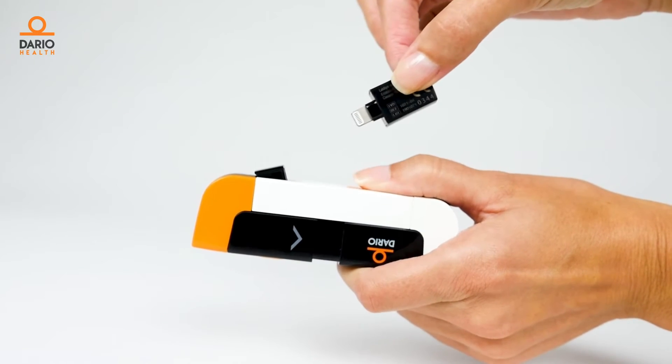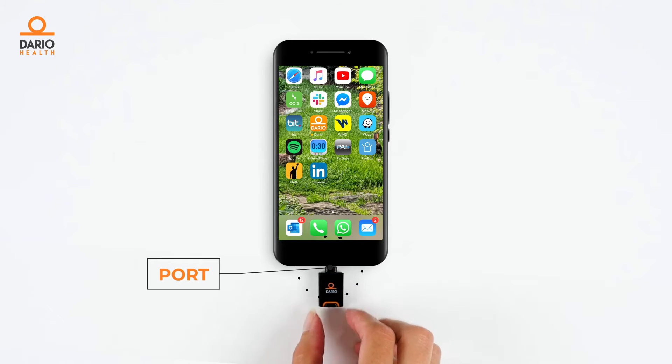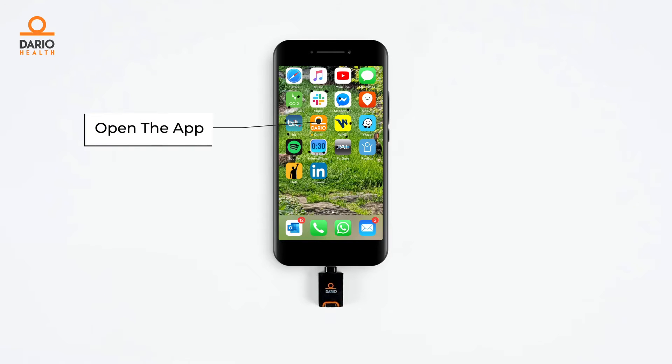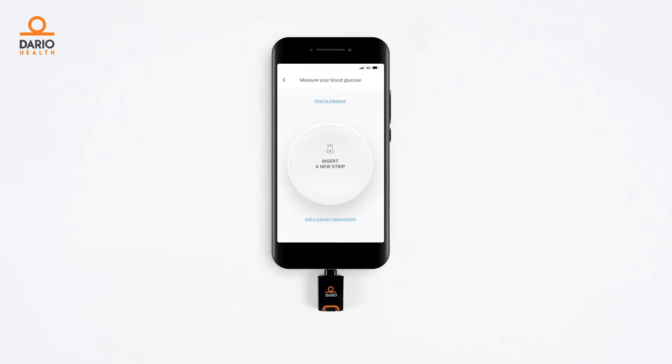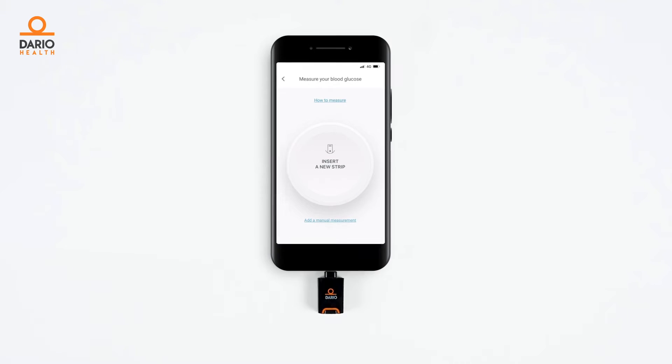Depending on your mobile device, plug the meter into the correct port. Open the Dario app. You will see the connecting screen, and then wait for the 'Insert a New Strip' message to appear.